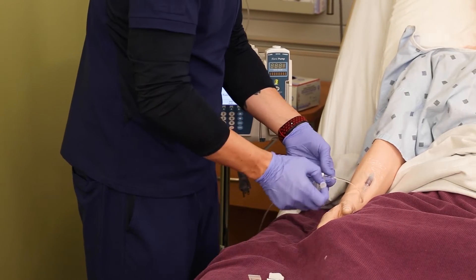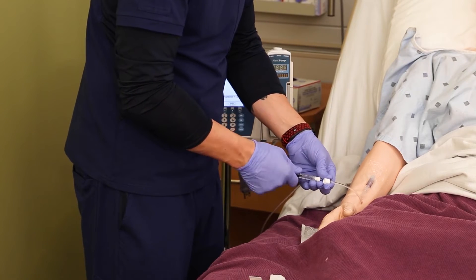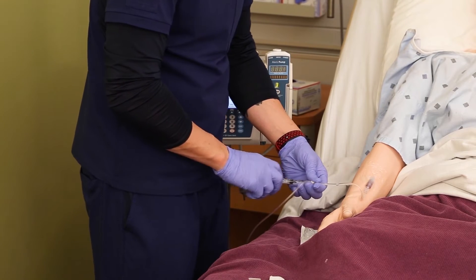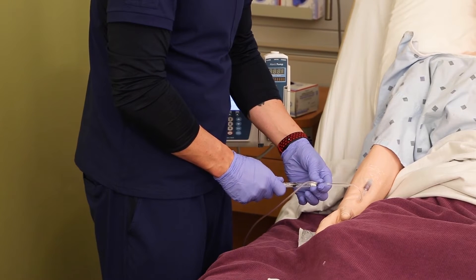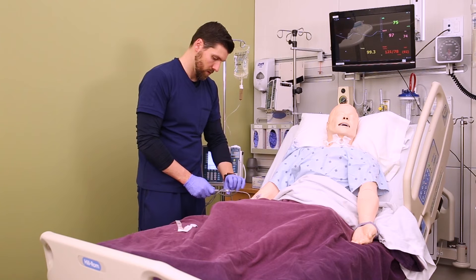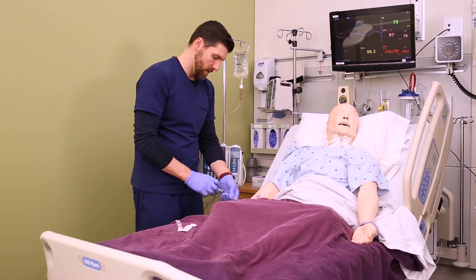Now take an alcohol pad and clean the port closest to the patient, and attach your IV push medication syringe there at that port. With that secondary infusion running, you're going to push the partial dose you calculated and count to 15 seconds. So push 0.25 milliliters, count to 15 seconds, push 0.25 milliliters, and count to 15 seconds, and keep doing that until you've given the whole dose.